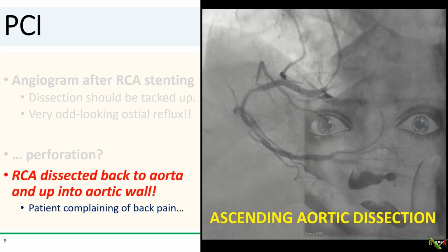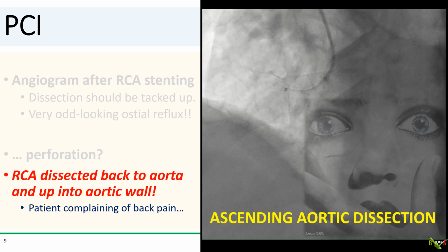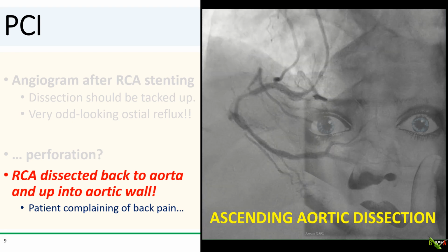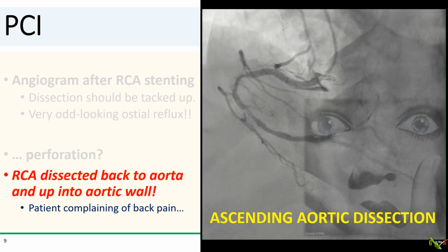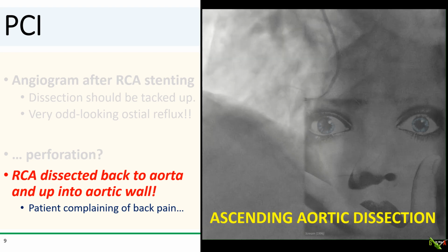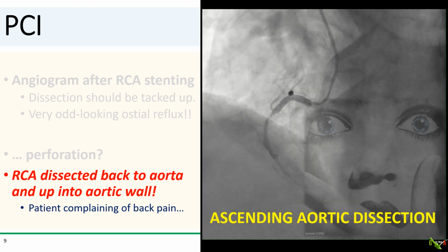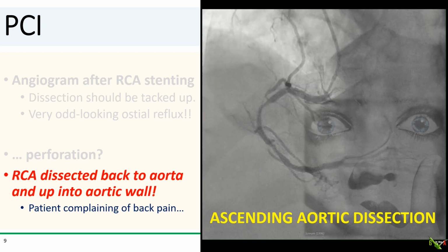But then the patient started complaining of back pain, and then the unthinkable dawned on us. The RCA had dissected back to the aorta and up into the aortic wall. The contrast that we are seeing is blood dumping into the false lumen of the ascending aorta through a wide open tract from the ostium of the proximal RCA into the aortic wall. We were dealing with an actively dissecting ascending aorta.